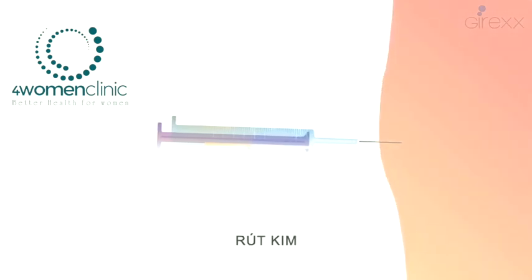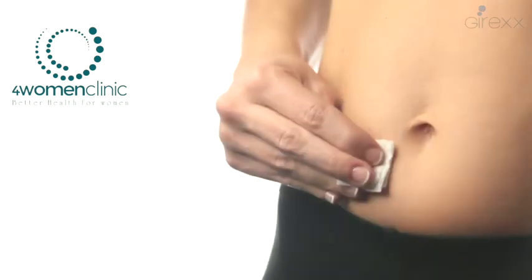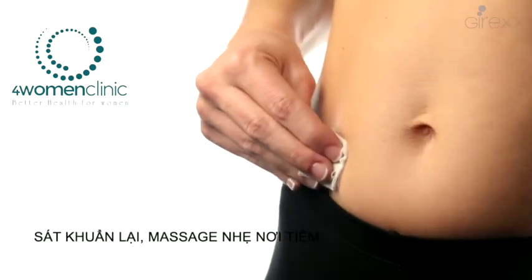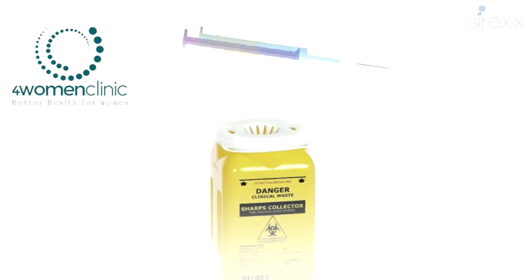Stop pinching the skin and remove the needle slowly. Press for a few seconds with sterile gauze impregnated with alcohol, giving a light massage. Once used, throw the syringe into a special container.